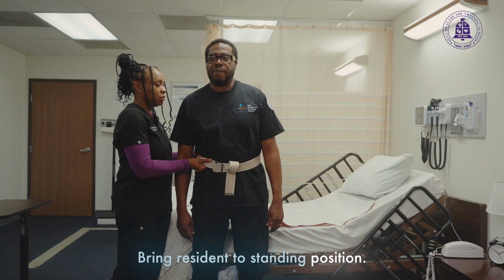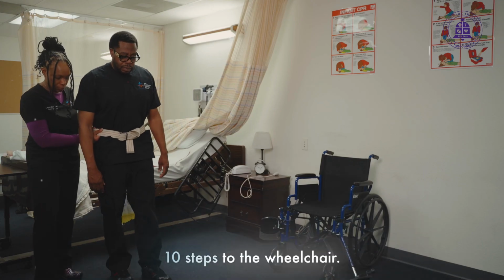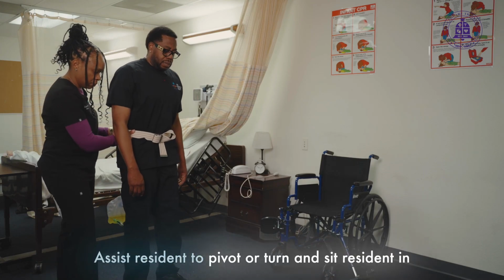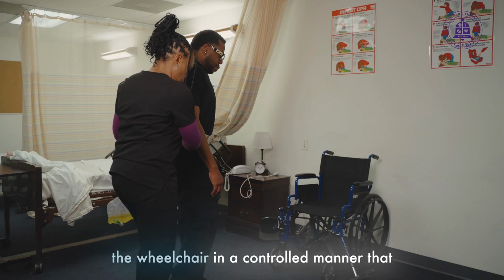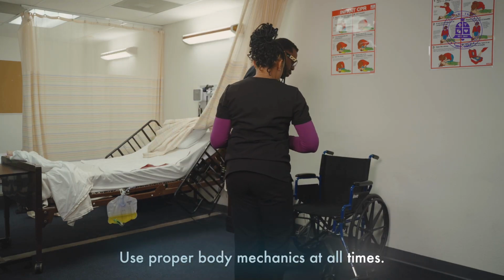Bring resident to standing position. Stabilize the resident. Ambulate resident at least 10 steps to the wheelchair. Assist resident to pivot or turn and sit resident in the wheelchair in a controlled manner that ensures safety. Use proper body mechanics at all times.